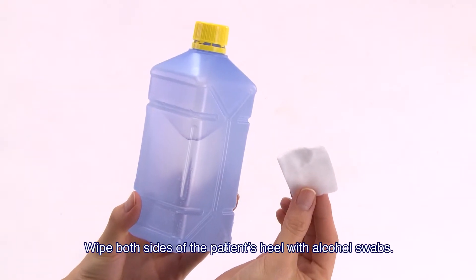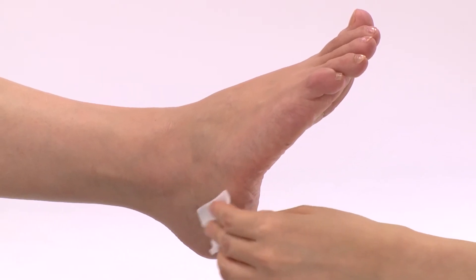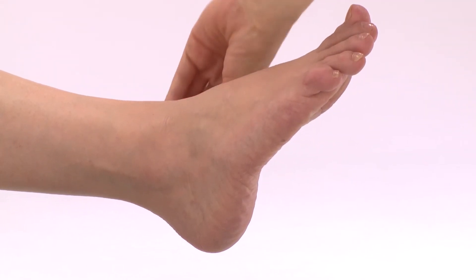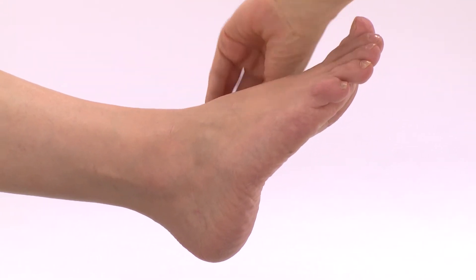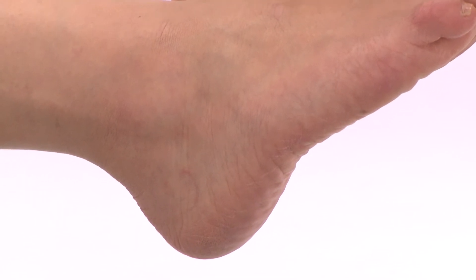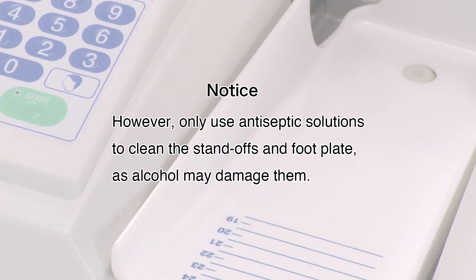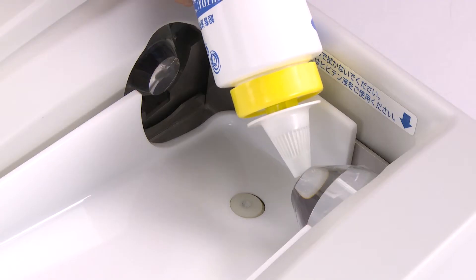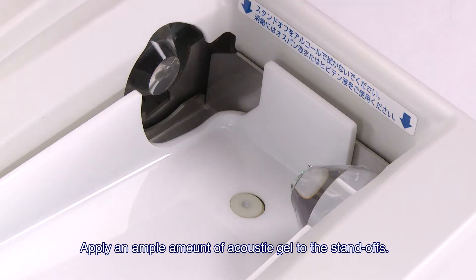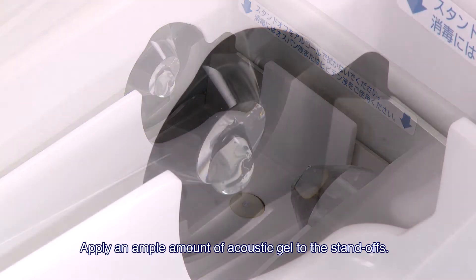Wipe both sides of the patient's heel with alcohol swabs. The aim is to remove skin surface oils and allow clear ultrasound transmission. Please wipe the area carefully. However, only use antiseptic solutions to clean the standoffs and footplate, as alcohol may damage them. Apply an ample amount of acoustic gel to the standoffs, taking care not to drop the gel onto the unit.